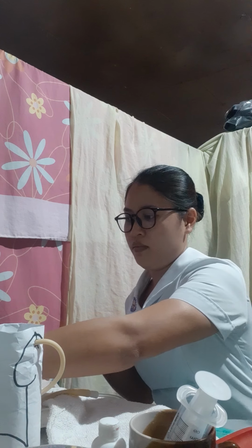So next, prepare the client. After preparing the client, perform hand hygiene. Using aseptic technique, open supplies and pour the irrigating solution into the sterile basin or receptacle.